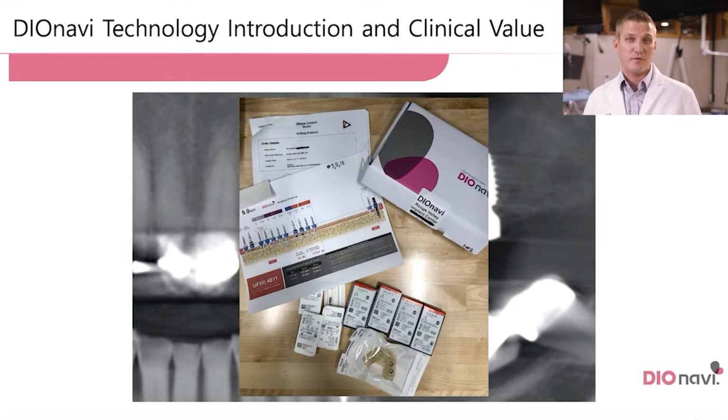I really appreciate what the case in the box can do. And so those are some of the things that I think are highlights of the DIOnavi system, how the technology benefits you, me, and the patient. I hope you enjoyed that. Let's keep moving forward.